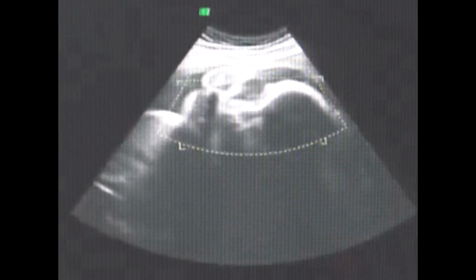All covered up now. She's like, okay, I've had enough. Can you see her? Her leg, this is her calf muscle, obviously her thigh, her arm, and then behind that, this is her head. Oh my God, this is her forehead, all covered. Now she stretched this leg out, parallel with her arm.